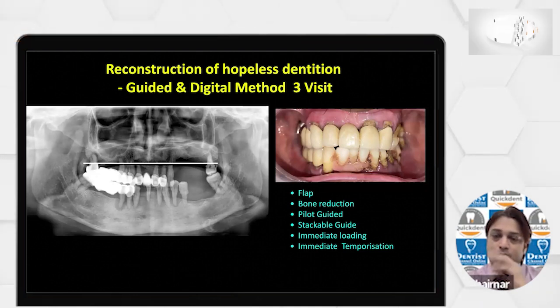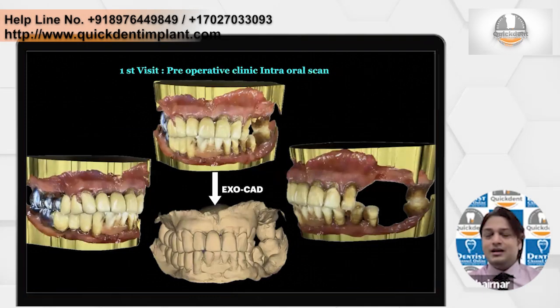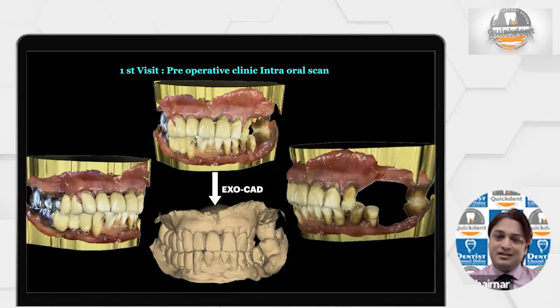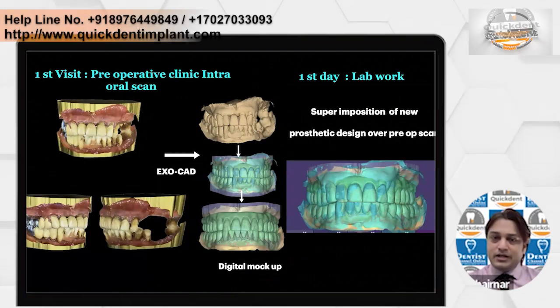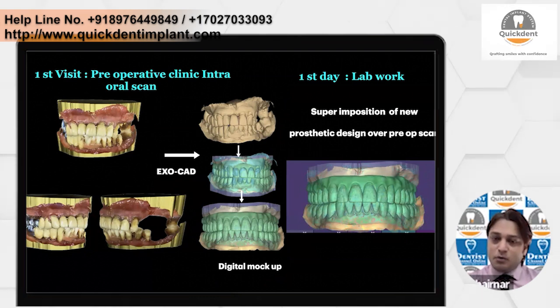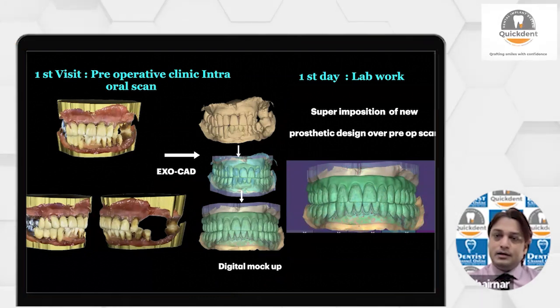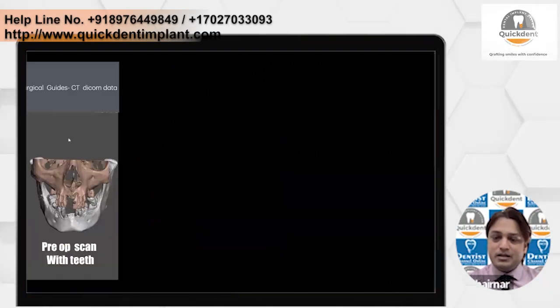So what we designed in this case was a stackable guide. Now, what is a stackable guide? I'll come to that. Now, this is the pre-operative situation of the patient. Same way, we recorded everything and we sent it to ExoCAD. They got this data, and according to this data, he made a digital mock-up. You can see the digital mock-up in the lower aspect, and superimposition of the old data with the new data, and then he made a digital mock-up.